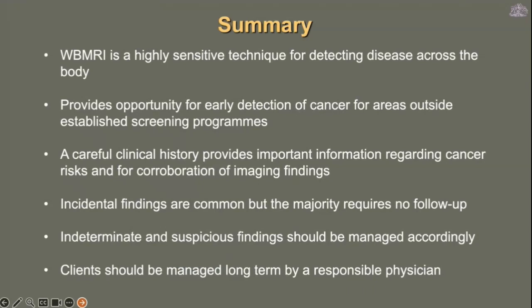So in summary, I just want to outline that in this short talk, I have shown that whole body MRI is a highly sensitive technique for detecting disease or tumors across the body. It provides an opportunity for early detection of cancers in areas outside established screening programs. However, we need to operate with good clinicians and referrers, because a careful clinical history provides important information regarding cancer risk and for corroboration of the imaging findings.